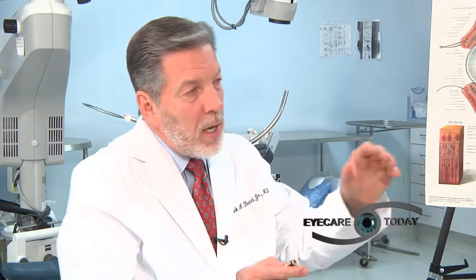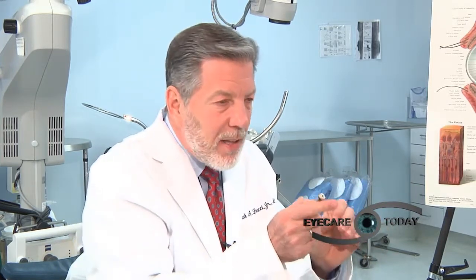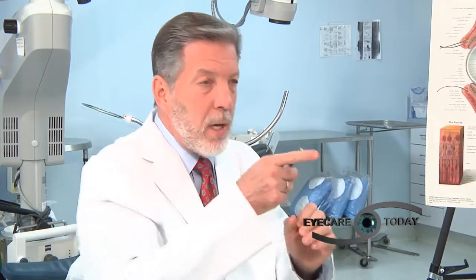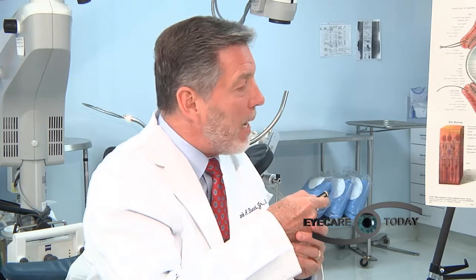Yeah, and you'll see there's a little visualization involved, and then delicately placing the stent in the proper place, and we're going to show you some videos of that so you can appreciate it. It's a very fine microscopic procedure, and you're actually going to see the little snorkel, the little port where you can imagine the fluid in the eye actually exiting, and it's sticking out right there. And actually right here is a picture of it.